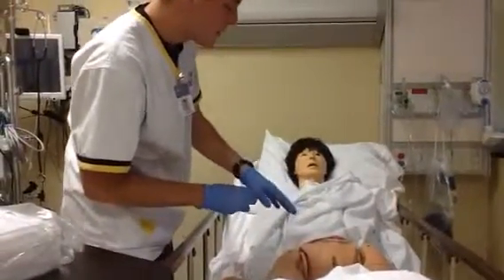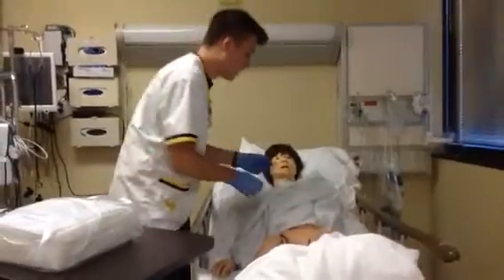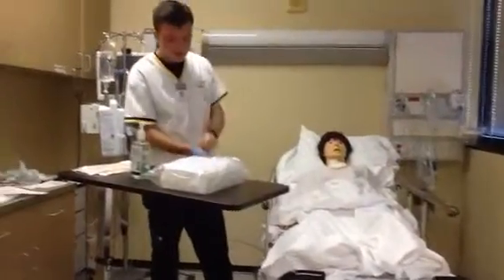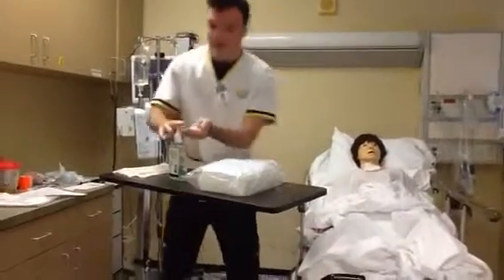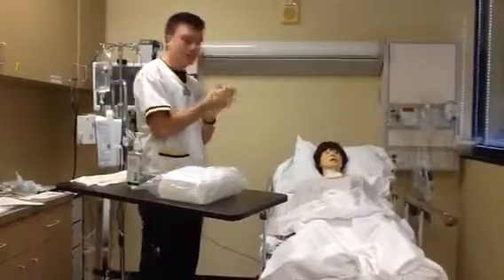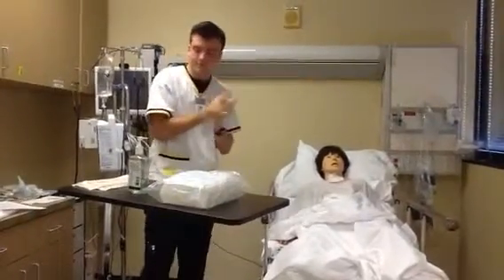not need to perform any perineal care, and I will cover her back up, take off my gloves, perform hand hygiene, and I would say, Mrs. Knight, I understand that you need a catheter. I'm going to go get that for you, and I'll be right back.